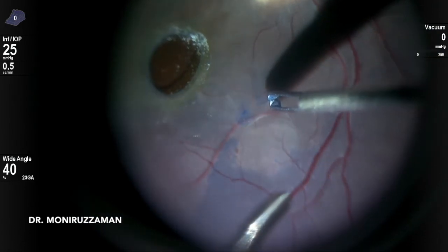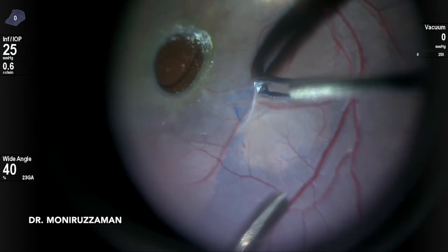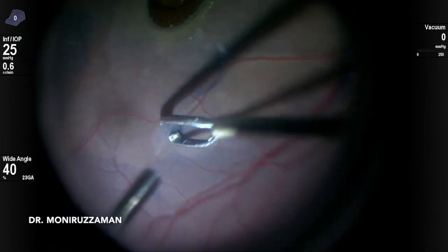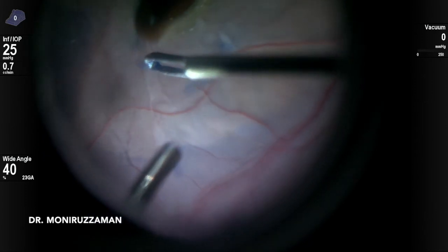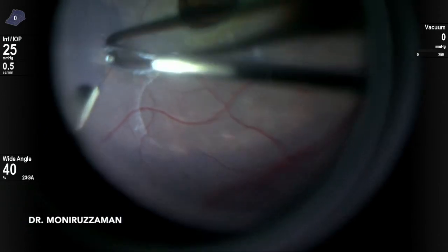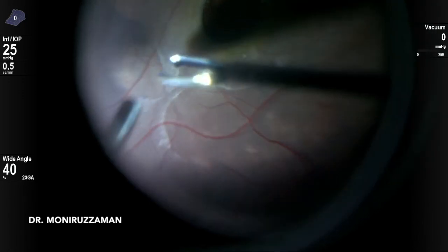I started peeling from a stained area, but after some time it seemed some retinal layer was coming with it. Starting from another side, the same thing was happening. Tried all over the area — they had become adherent.